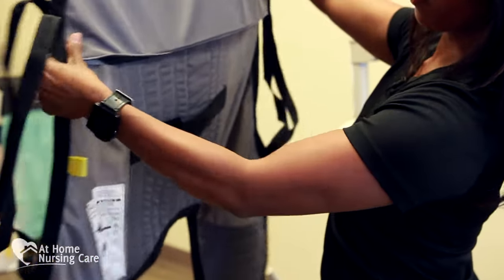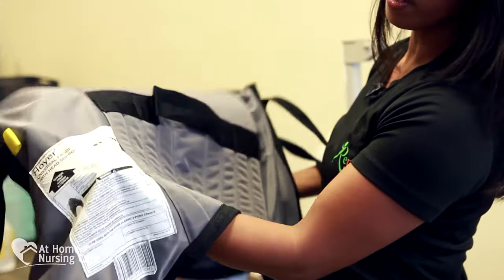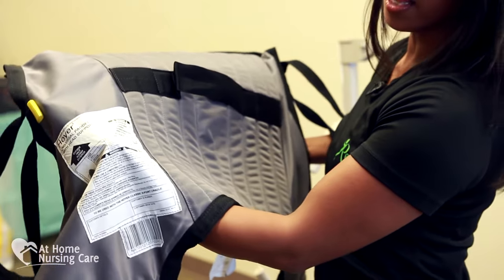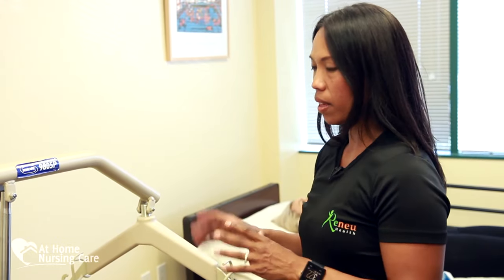An important part of the sling is knowing the weight capacity. You need to check the label to make sure it's within the weight capacity of your client — the label is usually on the back part of the sling. Once you've determined the type of sling your client needs and confirmed it's within weight capacity, we also need to take a look at the Hoyer lift itself and know its parts.